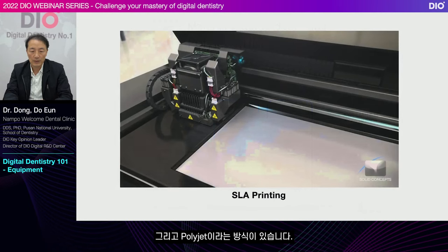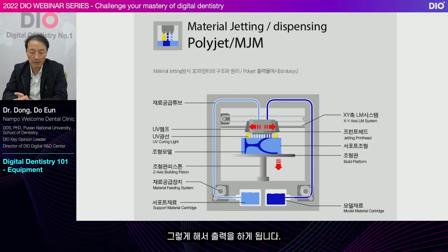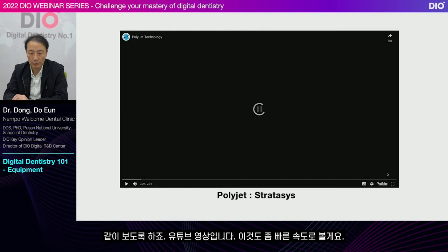And there is the polyjet method. It's called material jetting. The method is similar. Through the tube, there is the model material that becomes the supporter, and the supporter material comes out together. So it gets extracted. Let's check this through a video too. This product is called Stratasys. Let's watch it together. It's a YouTube video.